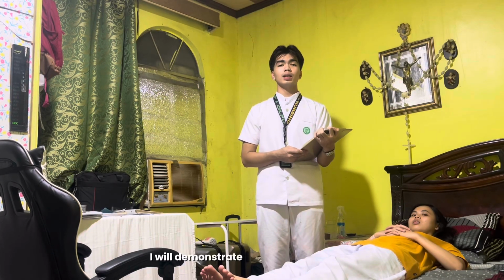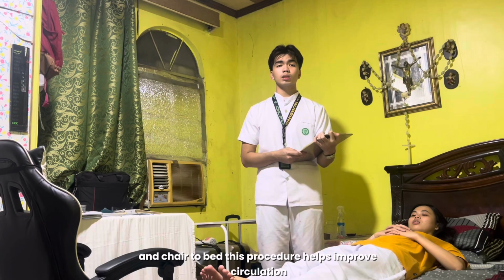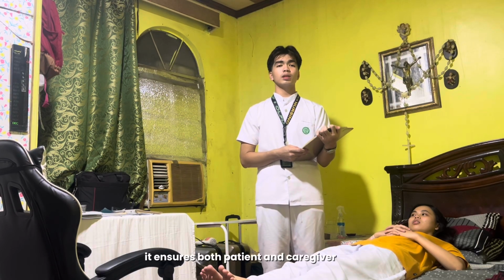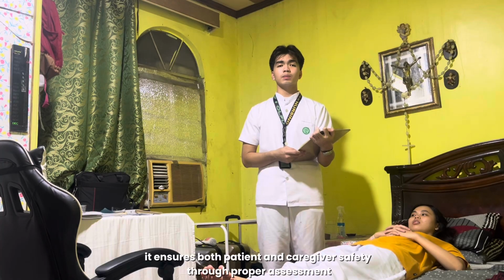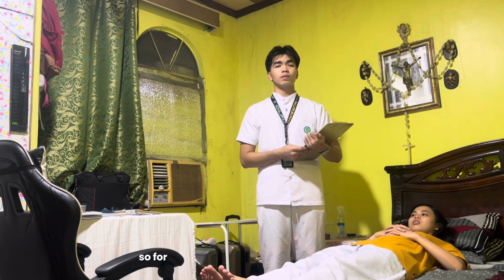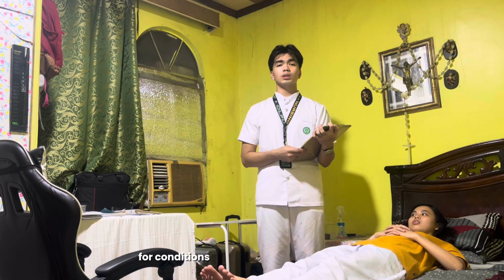So today, I will demonstrate how to safely transfer a patient from bed to chair and chair to bed. This procedure helps improve circulation, prevent bed sores, and promote independence. It ensures both patient and caregiver safety through proper assessment, body mechanics, and use of assistive devices like a gait belt.